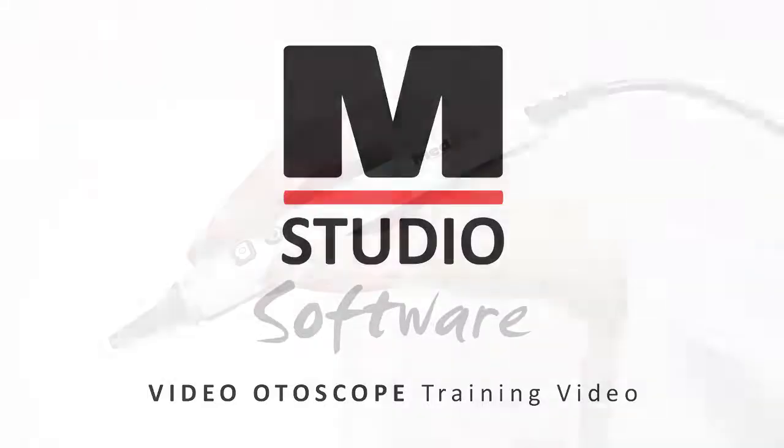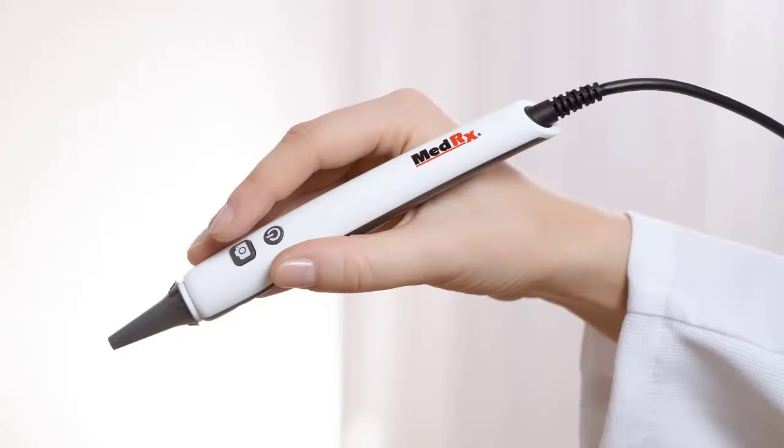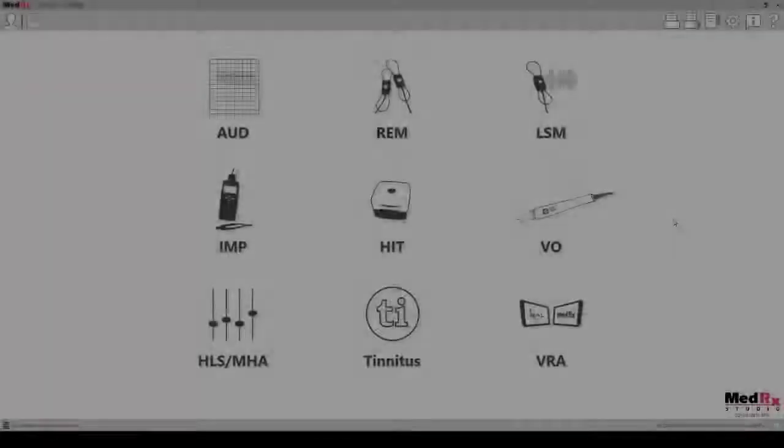In this video we will review the new USB video otoscope by Medrex and how to use the new otoscope in the Medrex Studio software.